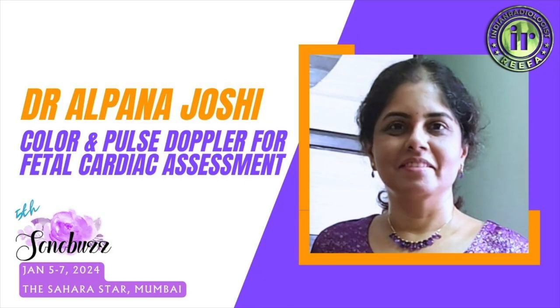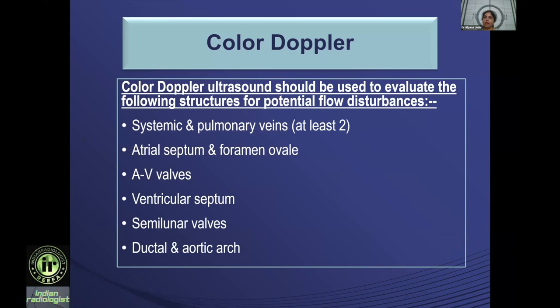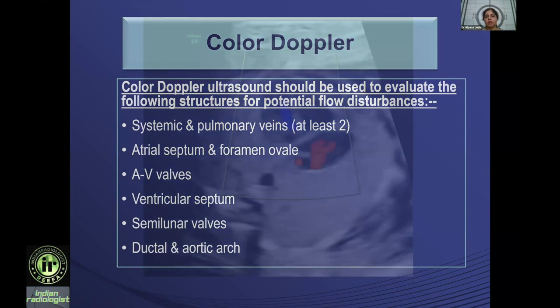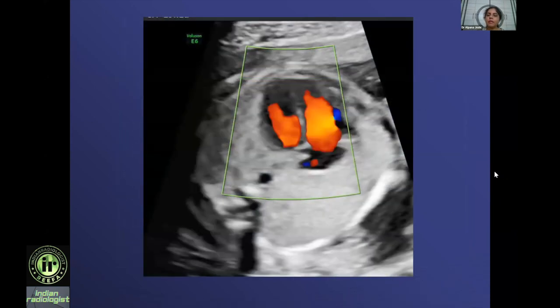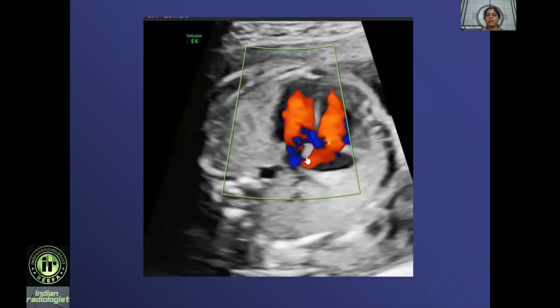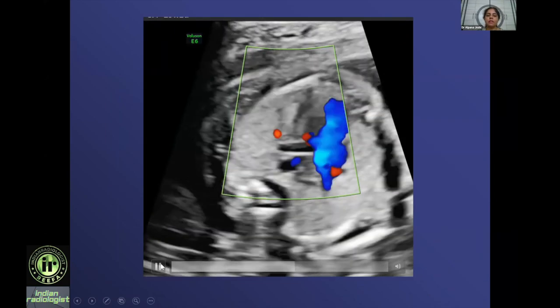The use of color Doppler is important to be well versed with. Color imaging is useful for systemic and pulmonary veins to see the flow, across the AV valves and ventricular septum especially if there is a VSD, a muscular VSD, semilunar valves, and the ductal and aortic arch.